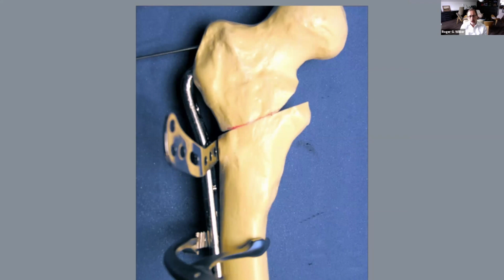Now, a little bit on offset compression, because Keith talked about offset compression. Anytime that you have a blade plate of a higher angle, say 110, 120, 130, you have to use offset compression to do this. And the way to do this is to have something that creates a gap here in the proximal part of the femur where the plate sits off of the bone, not in the distal aspect, but in the proximal aspect. Because you have an oblique osteotomy here that you want to get compression on, and you want to create a gap here where this yellow line is.